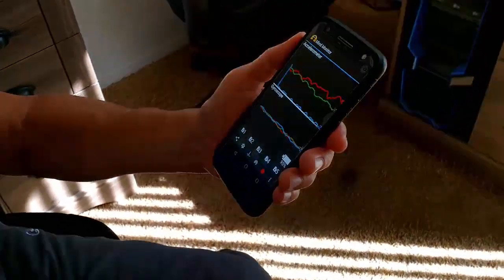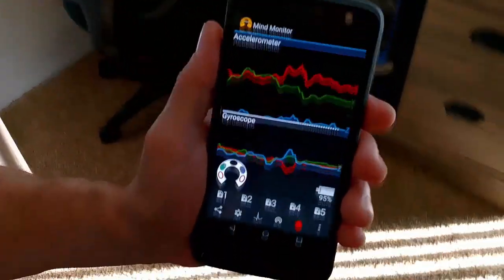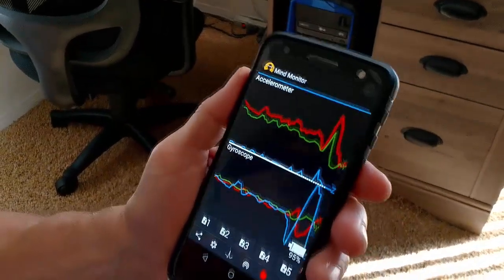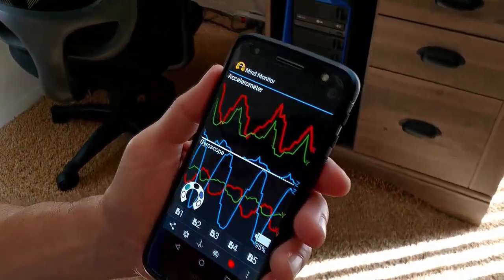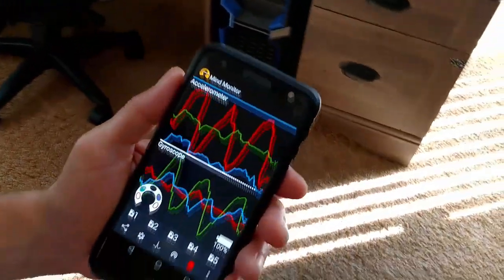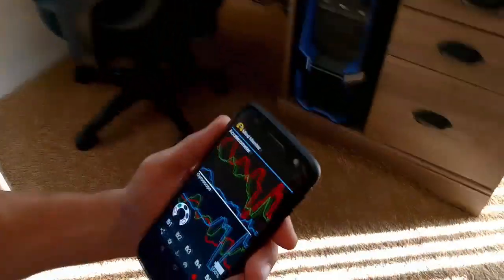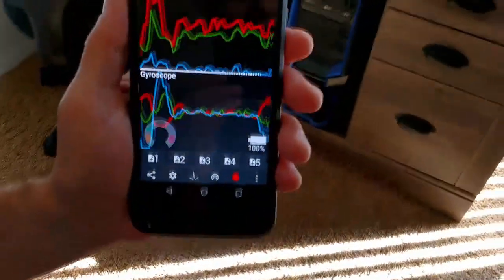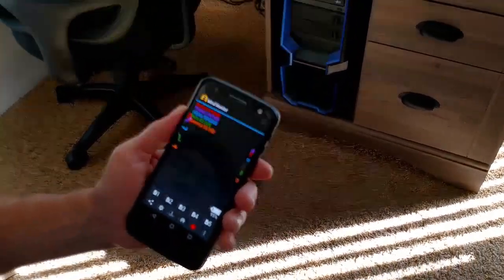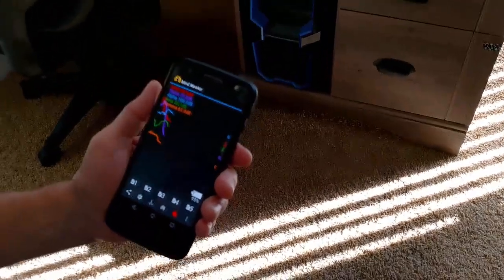This is interesting. This also contains an accelerometer, and again, once you get your system, yours will work the same as mine. But if, let's say, I turn my head left and right, you see what's happening? That shows that that's an accelerometer. If I move my head up and down like that, or left and right, you can see that. So that's a nice little addition as well. And then I'm going to go back to the standard waves, which is right there.